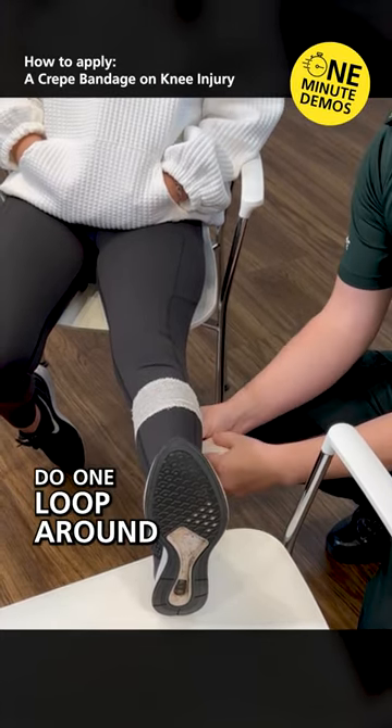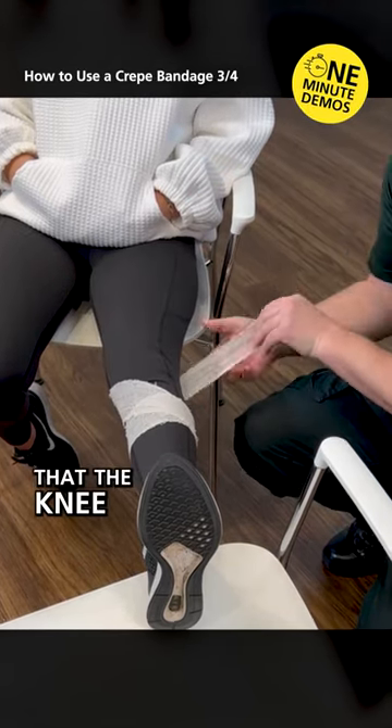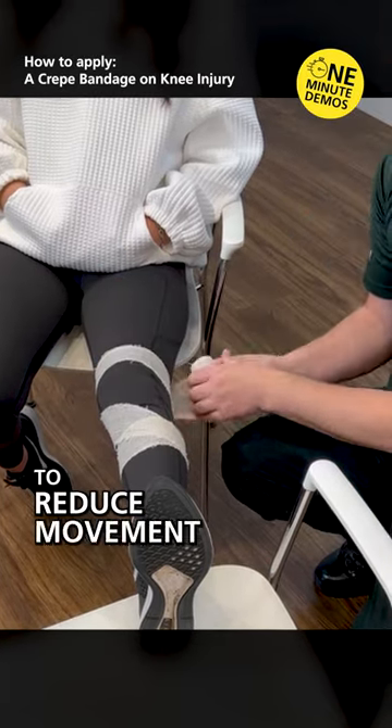Do one loop around and then we're going to go diagonally doing a figure of eight pattern. Ensure that when you put this on that the knee isn't twisted and it's straight, and always remember not to cover the knee cap. So we don't want to reduce movement above the knee.